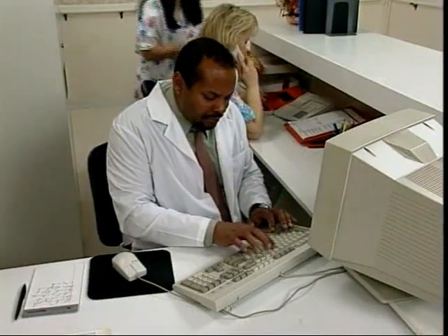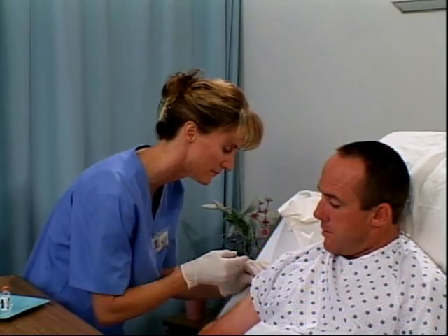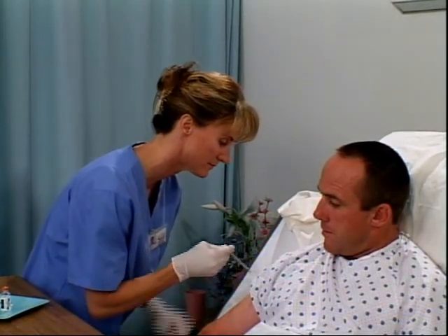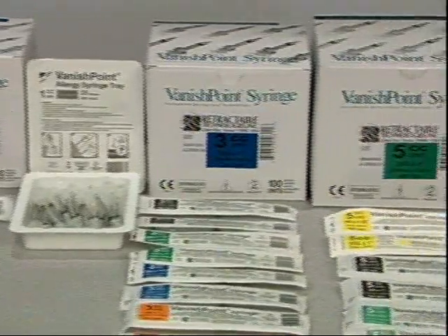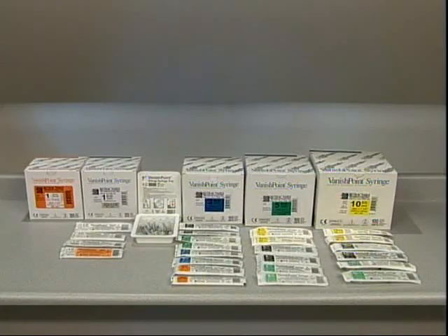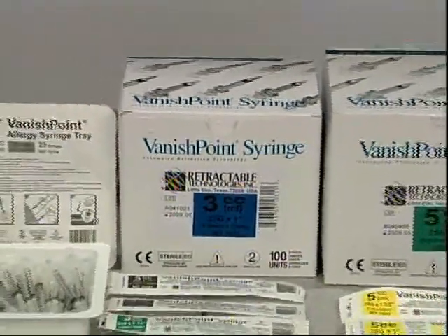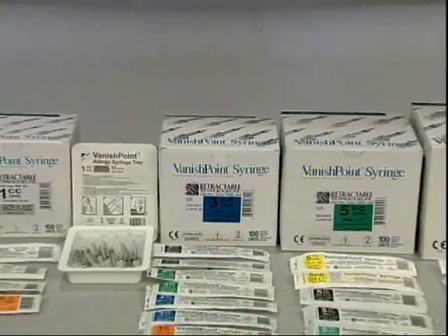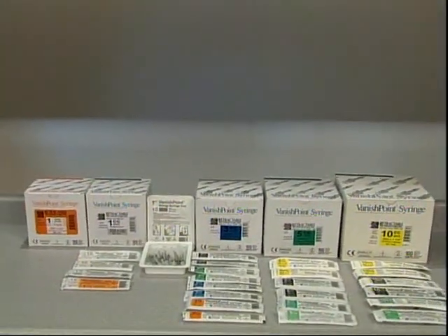The healthcare environment is busier than ever. VanishPoint syringes allow you to give injections safely, efficiently, and easily. VanishPoint has a full line of automated retraction syringes: 1ml, insulin, tuberculin, and allergy, as well as 3ml, 5ml, and 10ml, with a wide variety of needle lengths and gauges available to meet your injection needs.